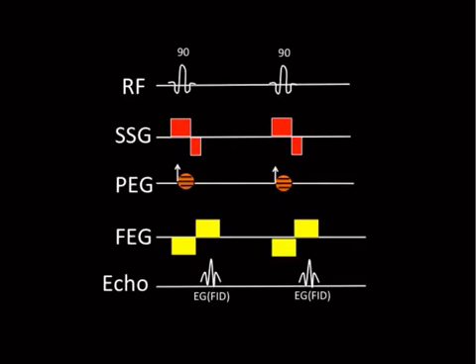So what makes them different is that gradient echo sequences, one, use a flip angle that's less than 90 degrees, and two, and this is the more important part, they do not have a 180 degree pulse. So when you're looking at the sequence diagrams, notice there's no 180, it just goes 90, 90. The advantage to this is that a low flip angle allows for faster recovery, which gives you shorter TR and TE times and a faster scan. The flip angle is used to determine how much transverse or how much longitudinal magnetization is going to be used.